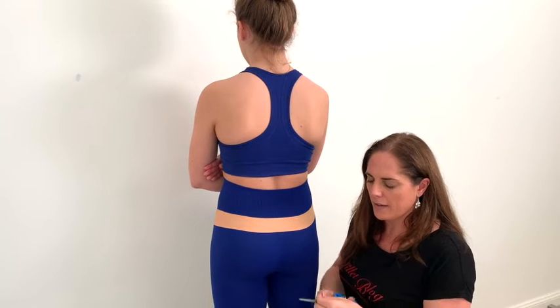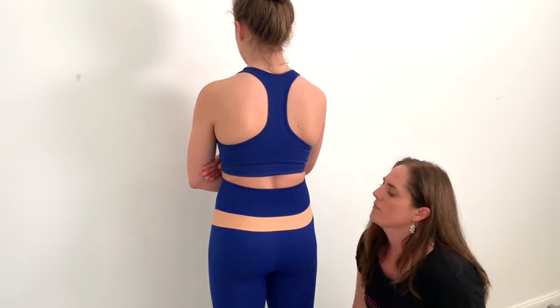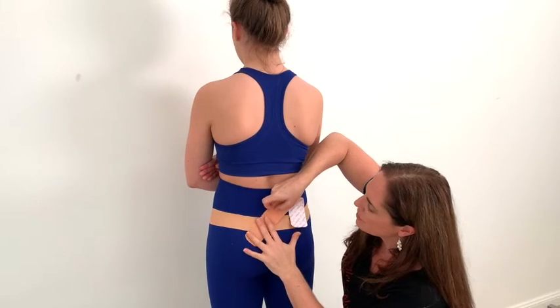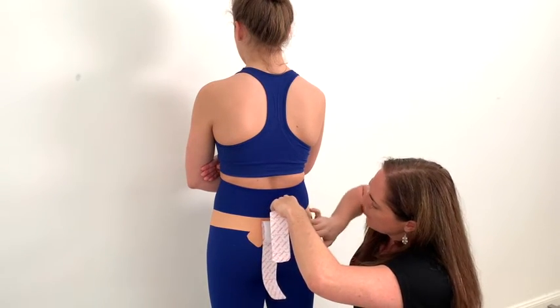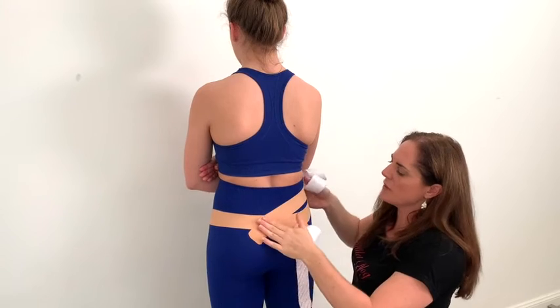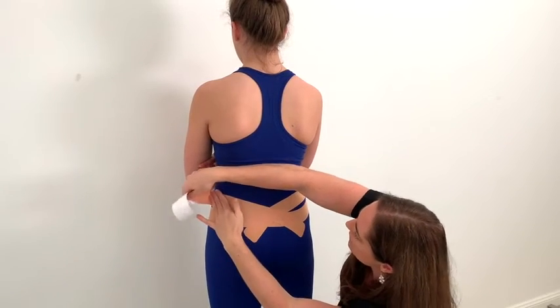Round off the corners and you can come from the bottom up or the top down — some people feel a difference with this. From the bottom up: starting from the middle of the butt cheek with a long anchor, apply quite a decent stretch up and over to the top, getting this connection of the top of the hip to the opposite side of the hip, and then the same around the other way.